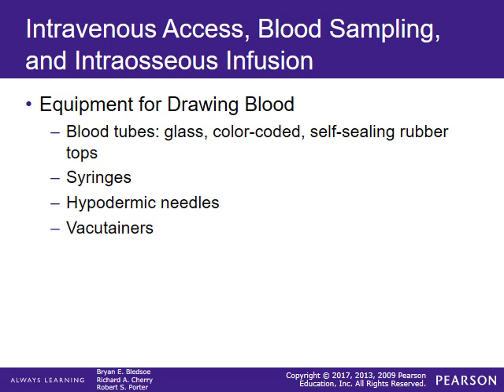Venous access for blood draws needs to be coordinated with the labs that will be analyzing the blood that you draw. The color-coded tubes, the way that you do them, and the labeling that you do on them is very particular to the labs. They have to know the times, the sites that it's drawn on, and typically what time of day it is drawn. So it is very appropriate for you to be in tune with whatever lab you work with, whatever facilities you transport to, and how they would like their blood draws done.